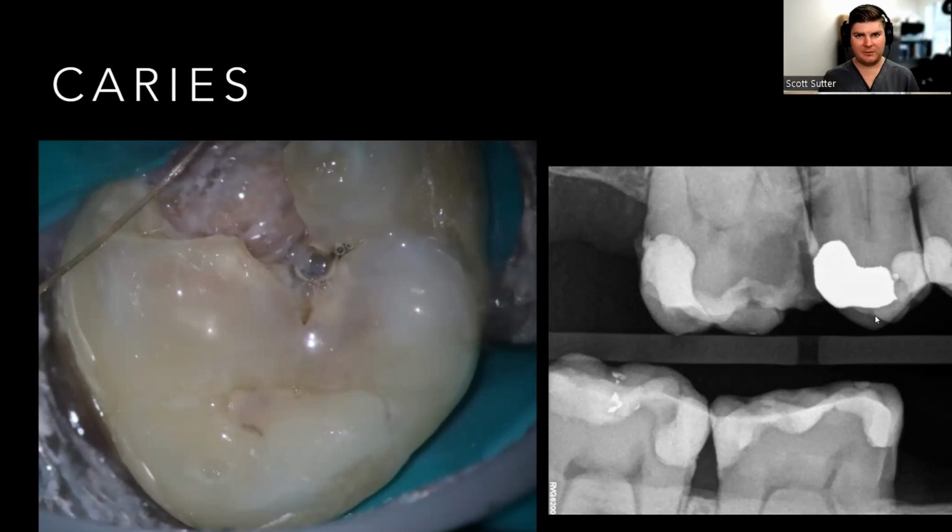Awesome. So with caries, what's happening here, if you look at the rest of his teeth, and this patient was about 40, give or take, you look at the pulps down here, maybe a little calcified, same thing down here. The premolars look okay, but in general, he's had a heavier dental load, is the nice way to put it. He's had multiple restorations. He has a little bit of perio. It looks like he's lost a tooth. These cusps are pretty high. We might be having some occlusal interferences, especially because this one's so flat. And we have the decay in here.